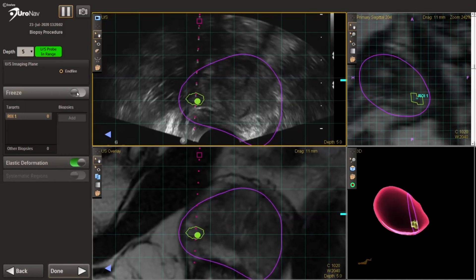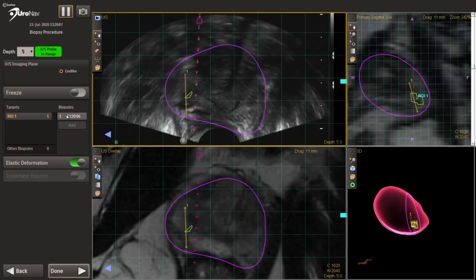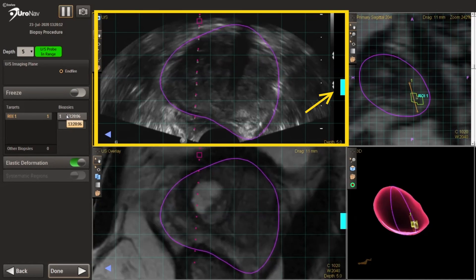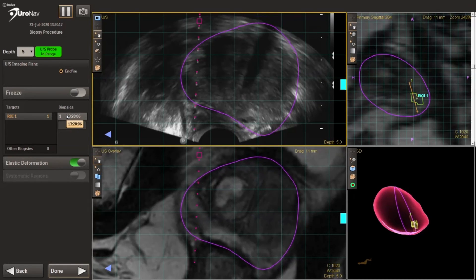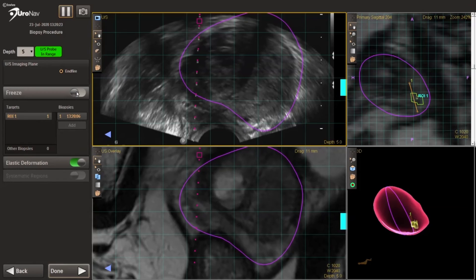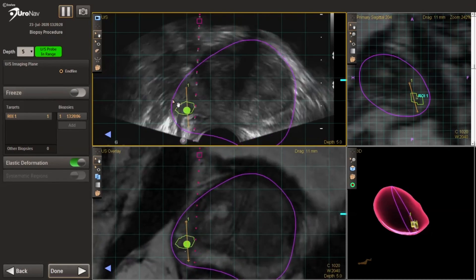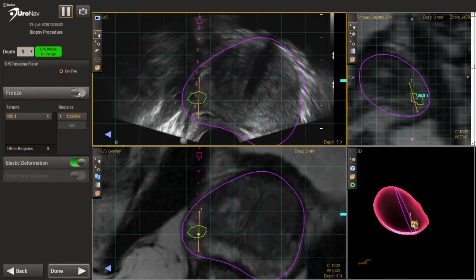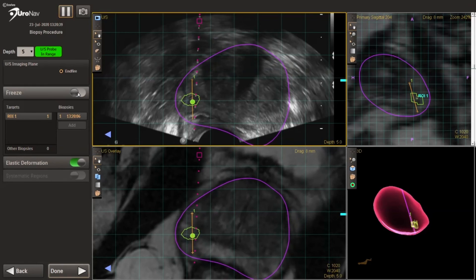I then take a biopsy, and my assistant marks the position of the biopsy. Also of note, the blue bar in the top left box tells you spatially how close or how far you are from the lesion, and it helps when lining up the needle. I use that routinely to get everything lined up. I typically will do two targeted biopsies for smaller lesions. If they're particularly large lesions, I may do four targeted biopsies — two targeting the periphery and two more centrally.